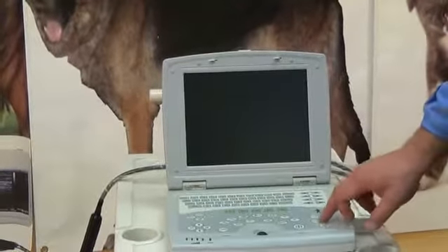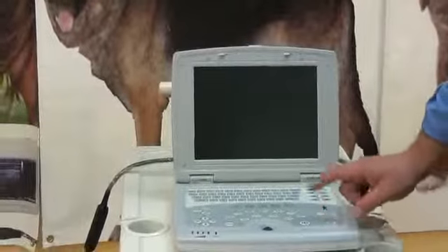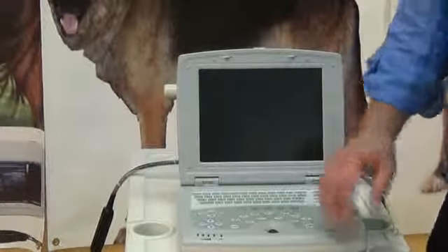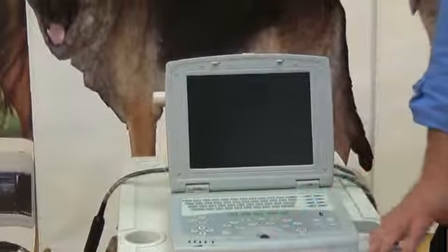And then finally, obviously, is the comment button. That's also self-explanatory. You hit it, you set where you want to type, and then hit again, and then you're out. So that's the basic rundown of the keyboard.